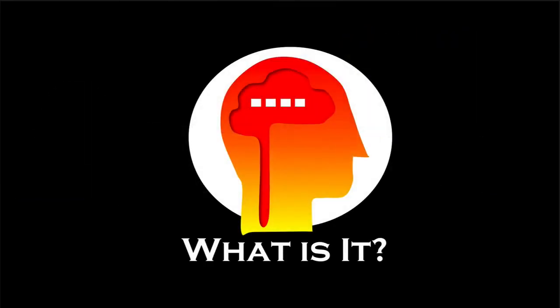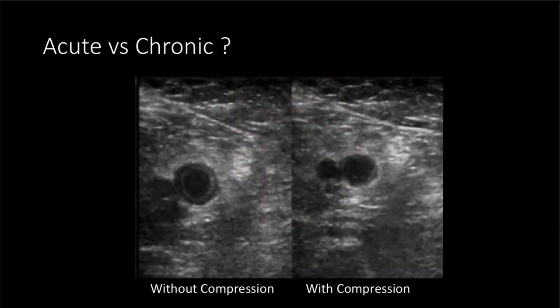All right, let's do a couple of cases. So showing you two images here. One is with compression, and one is without compression. So you're noticing that it's not changing, right? So there's a DVT there, but that's not the question. The question is: is it acute or chronic, and how can you tell the difference?